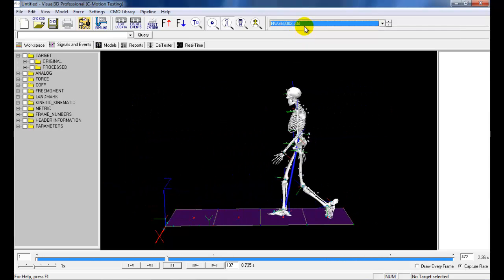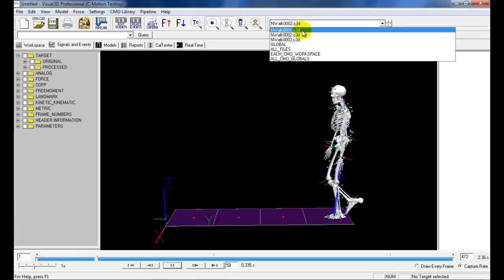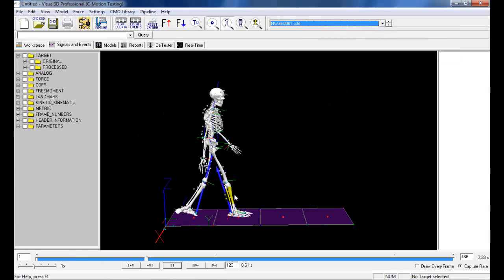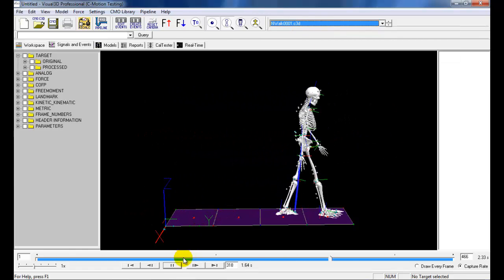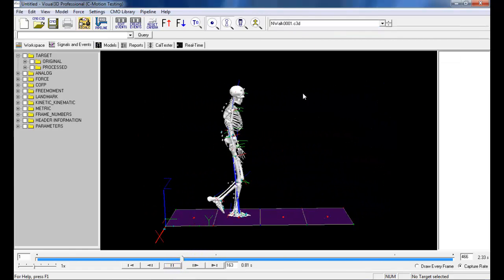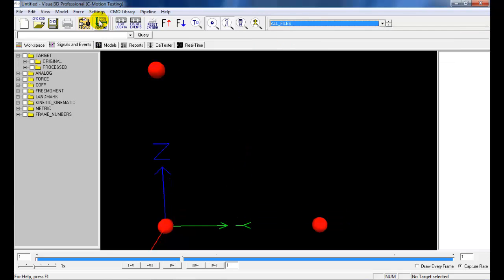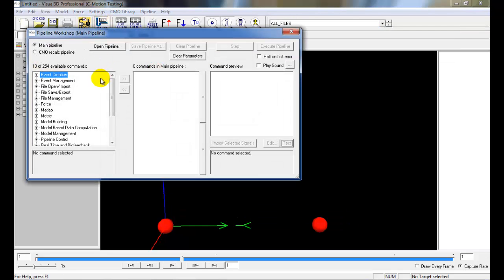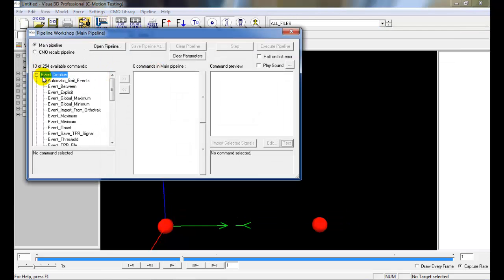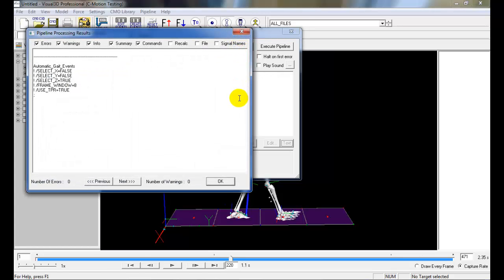Force assignments should be verified before applying the automatic gait event, because gait events are actually based on the force assignments. Once force assignments have been verified, it is possible to run the automatic gait event to identify the heel strikes and toe-off, as well as force plate contacts throughout the trials.